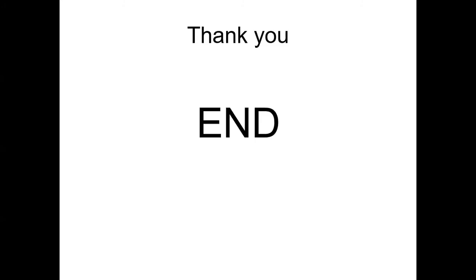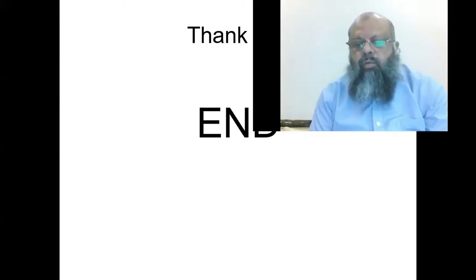We have a couple of questions at the end. The first question is from someone from Sudan. He's asking how can we do the differential diagnosis of infection on X-ray? Is it possible? Well, it is possible.